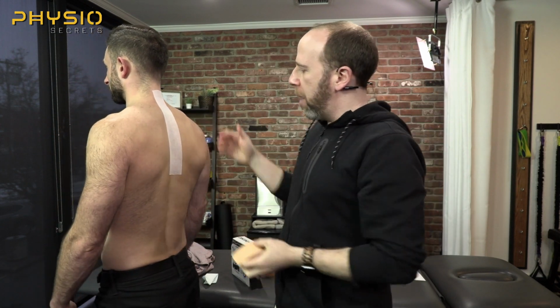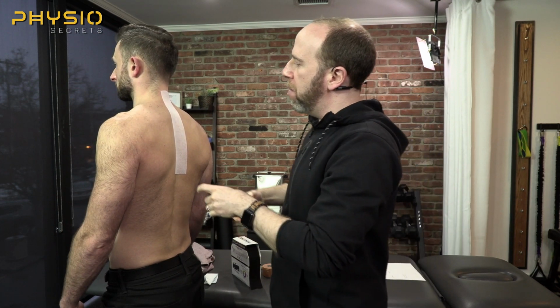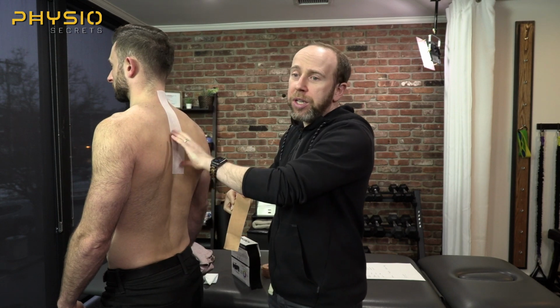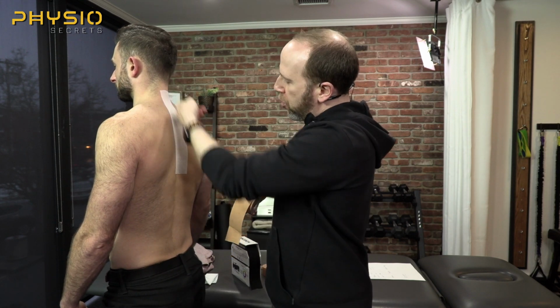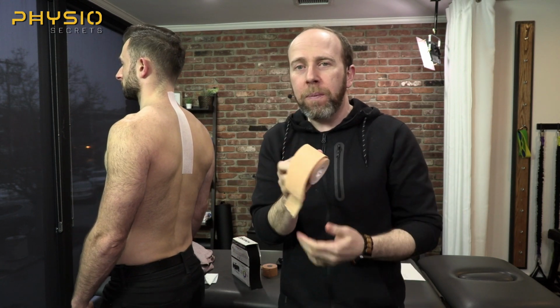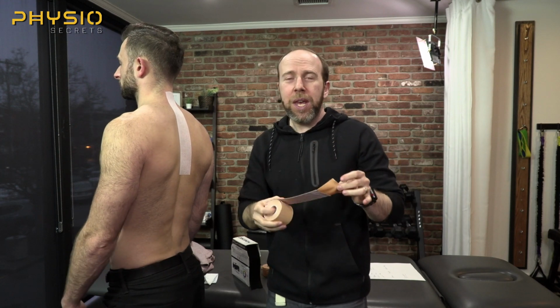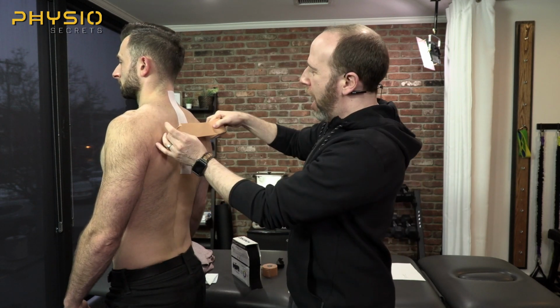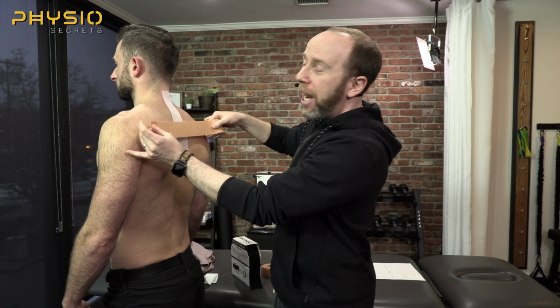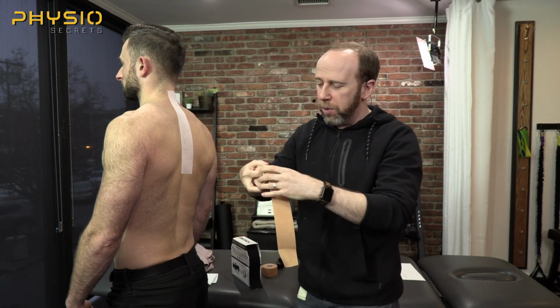So we're going to do a periscapular application to hold those scapula back. And what I'm going to do first is pre-measure. Now, when I pre-measure with the posture tape or the coverall, I can pre-measure the exact distance. But when you pre-measure with flexible tape, you must know how much this tape stretches and how long you're going to make the piece, because that's going to determine how you measure this distance. If I measure it from here to here and I go to tape him, I'm going to end up way up here once I actually apply this thing with stretch.